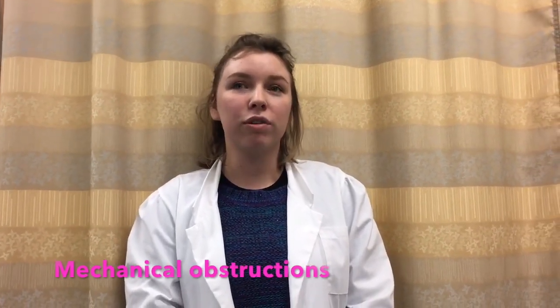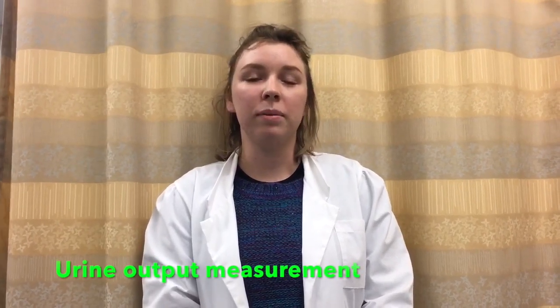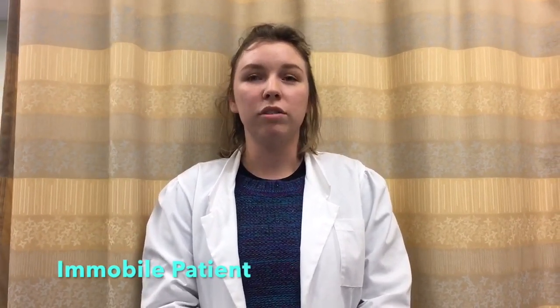A catheter is used to remove urine from the bladder in situations when there is a mechanical obstruction in the urethra or retention of urine due to a nerve block. It can also be used in cases when urine needs to be carefully measured. A catheter may also be used when a patient must be immobilized during many surgical procedures.